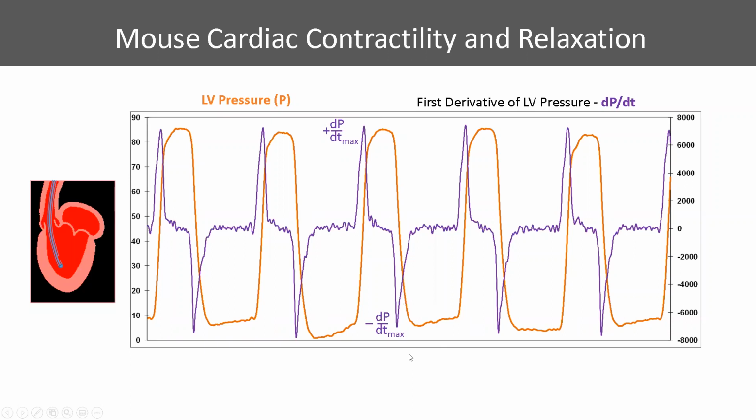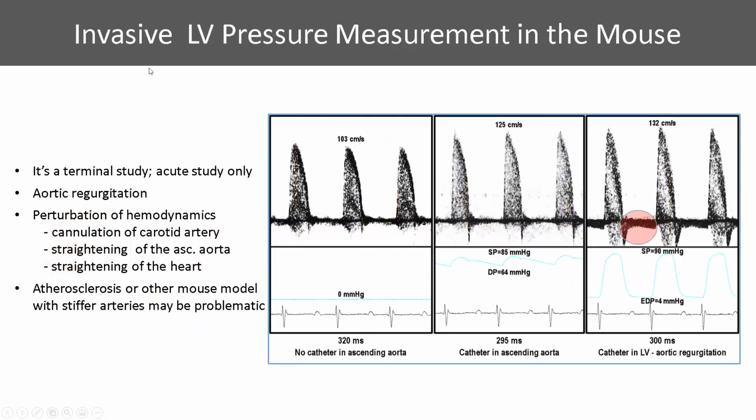Unfortunately, this is invasive, and most of the time the animals are terminated right at the end of the experiment. Looking at invasive versus non-invasive measurements, we already said it's a terminal study, and it's an acute study. That means anything that you have to do at that point, whether it's interventions or just getting baselines, that is it, and the study ends there.